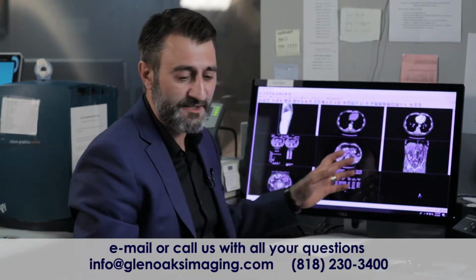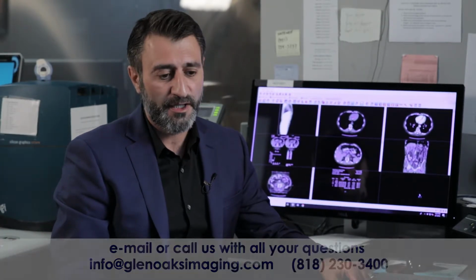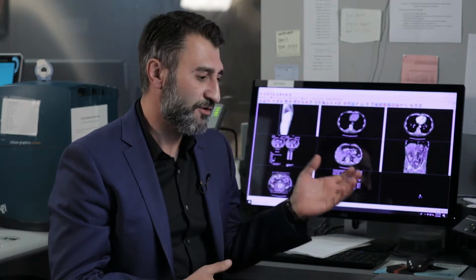Before I show you some CAT scan images, I wanted to tell you that CT of the abdomen is probably the most frequently ordered exam because of its clarity of the different organs and the accuracy of its diagnosis. CAT scan of the abdomen is ordered very frequently.